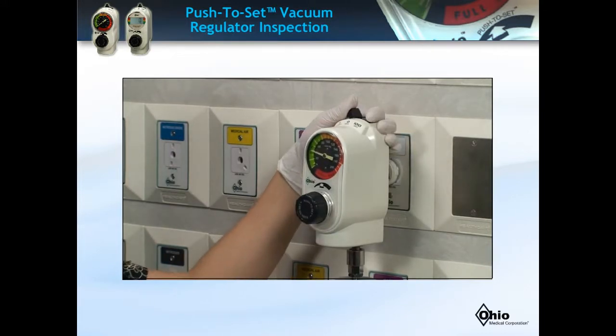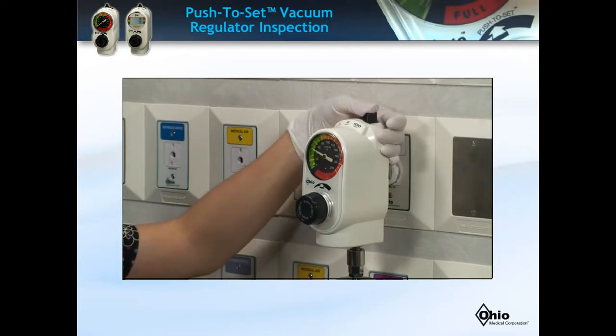Furthermore, inspect that when the unit is placed in the intermittent mode, the regulator cycles on and off.